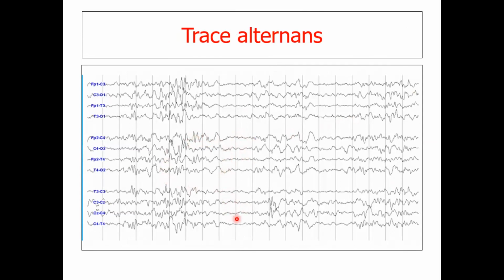The intervening period is the interburst interval, and these bursts have certain characteristics. It looks spiky. There are waves here, as you can see. So in case a neonatal EEG has very low amplitude, you would have to change the sensitivity in order to amplify the waves.